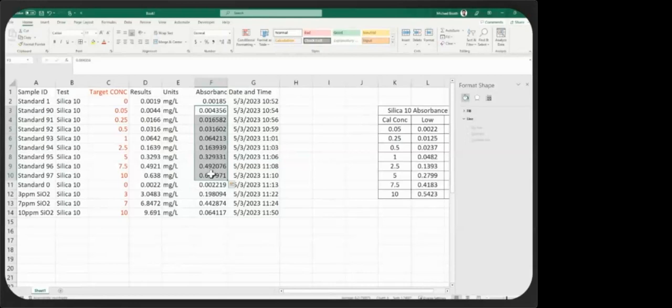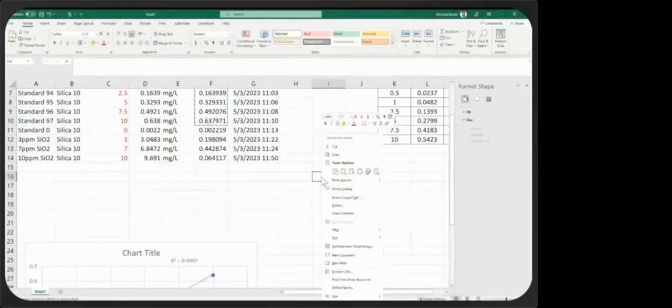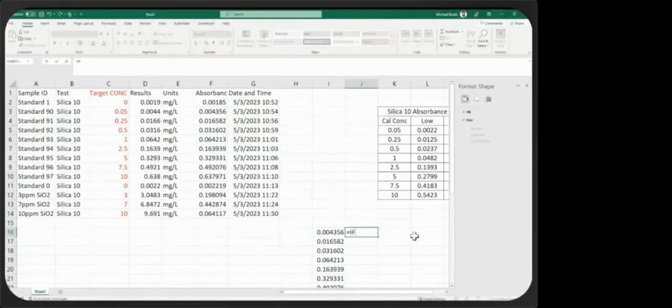So we're starting with our first low standard on this. I'm just going to copy this data down, paste it over here real quick, and then just do a simple check formula on it. See if we get a pass-fail on this data. So it should be real quick just to write the logic in to check it.